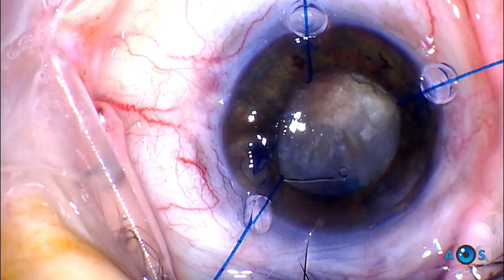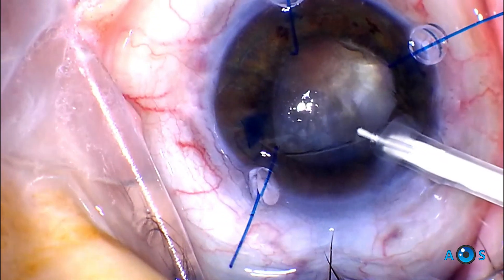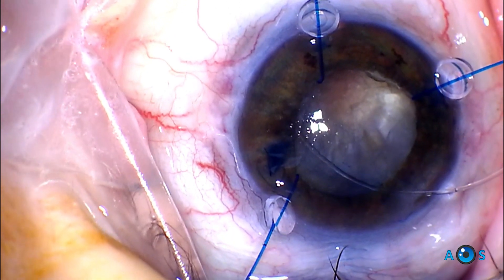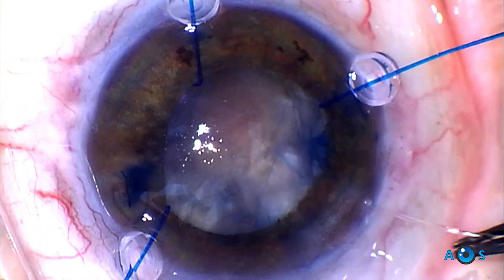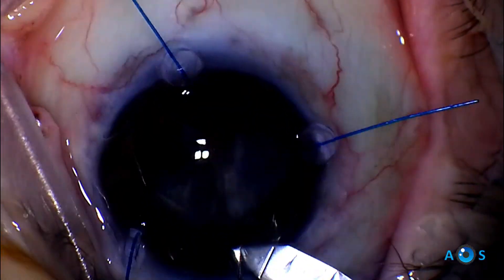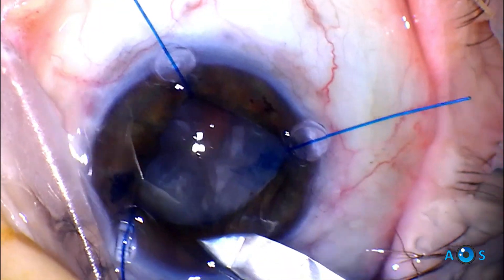The plan now is to convert to extracapsular cataract extraction. There is a risk that the CTR could create difficulty, so we first use the hook of the injector to capture and remove the CTR. Here is the first clue to what may have happened: the leading end is completely trapped in the capsule, which is dragged and now becomes extensively radially torn. So now the only option is intracapsular cataract extraction.